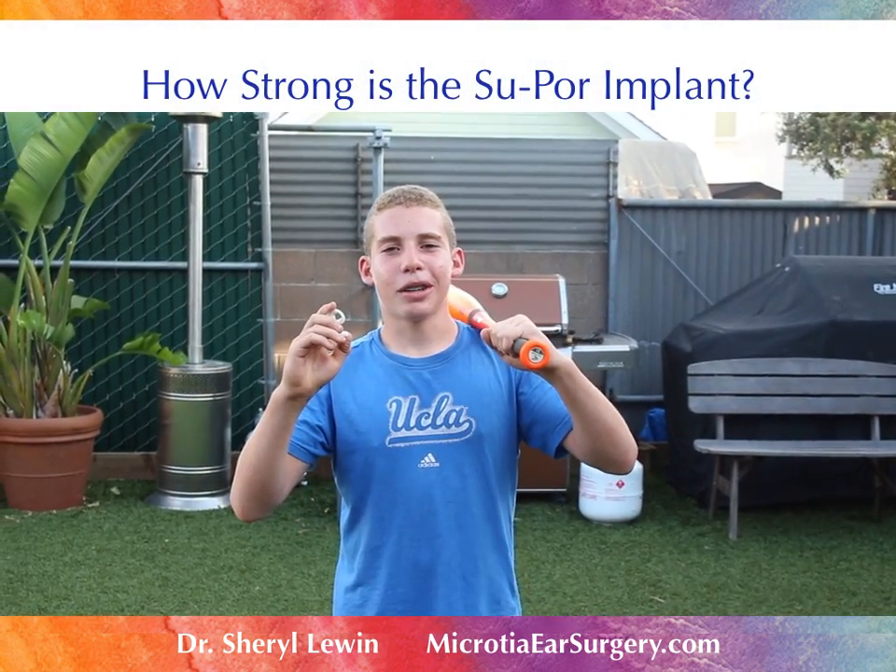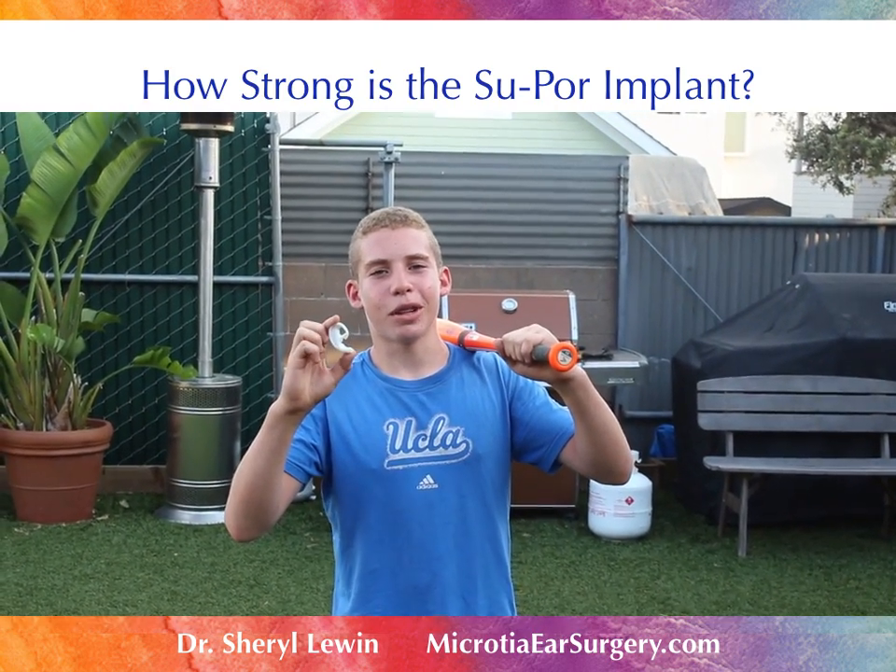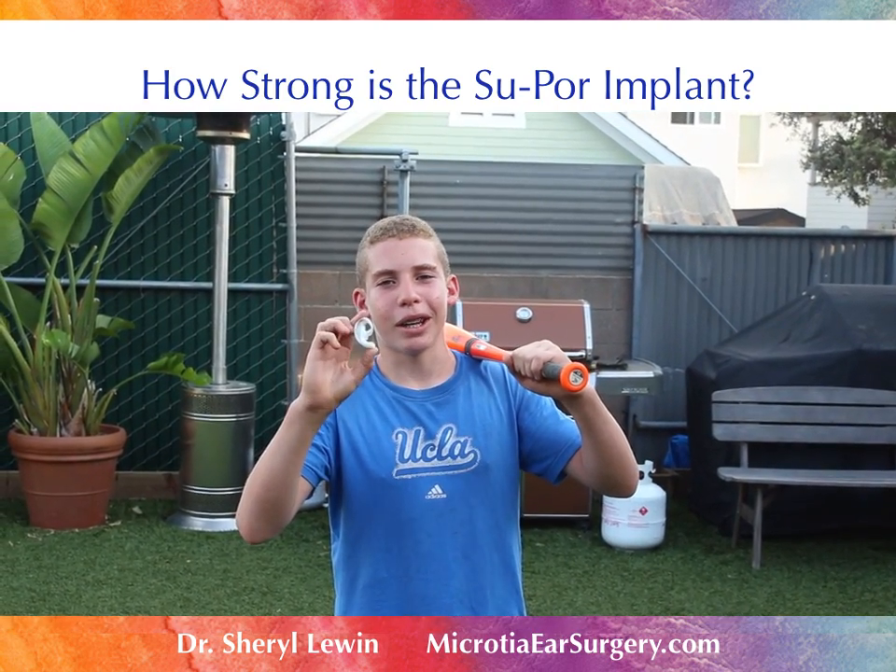Hi, I'm Jeff, Dr. Lewin's son. I love baseball, so today she wants me to show you how strong the SUPOR implant is.